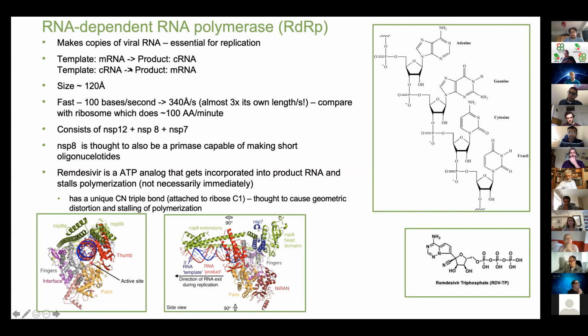And although this seems very trivial, it's important to keep in mind because when they create these duplex template primers to create their structures, what they actually mix and what they actually get does not necessarily have to be the same. So even at that stage, one has to be a little bit aware that you need to be sure that what you're actually mixing in as your RNA is actually what you're seeing. And I'll show you one example of where this is an issue.